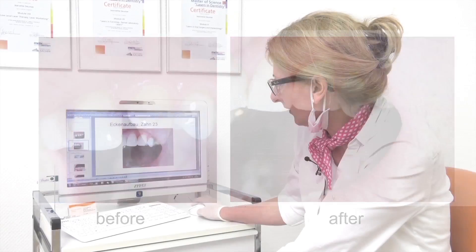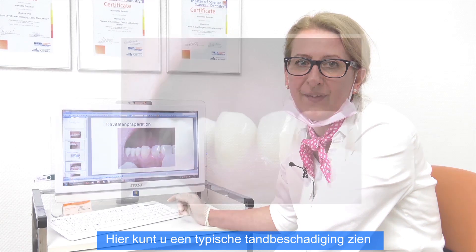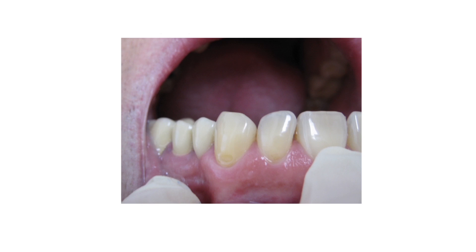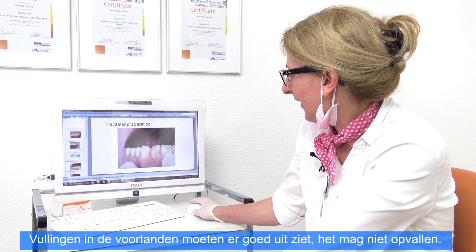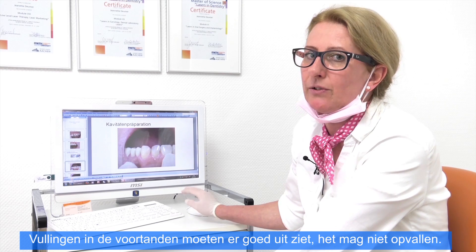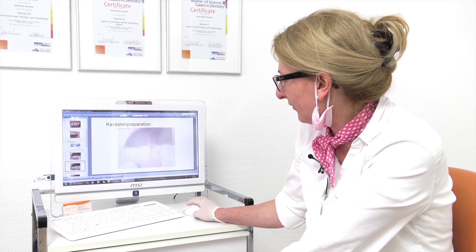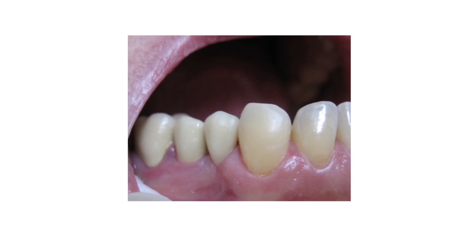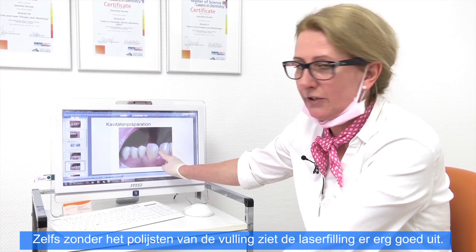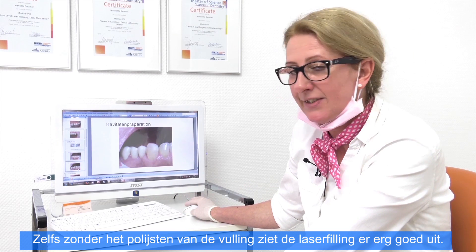This is a typical disease of teeth and it's very painful. In the anterior area it must look very, very good. Just have a look before and after — you can see the result is also fantastic. And remember, there is no polishing at the time and we already have a fantastic result.